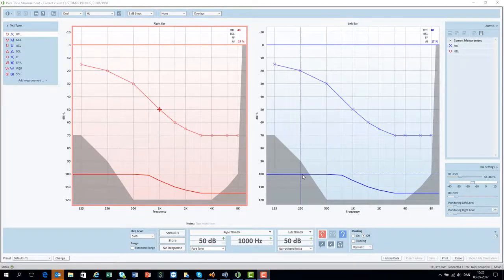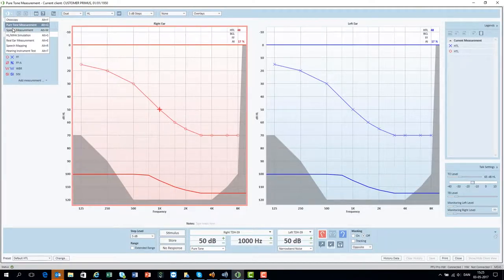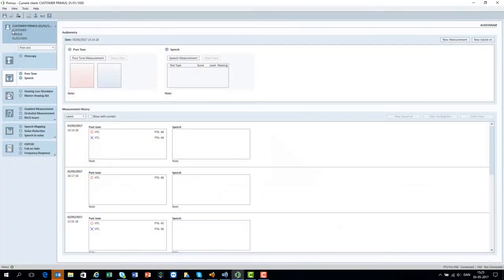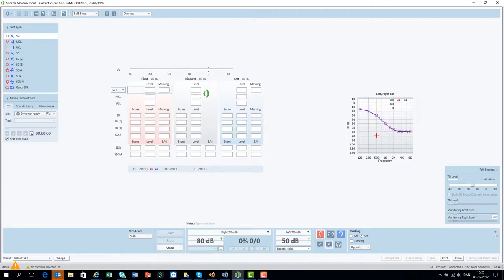In this video you'll learn how to operate the speech audiometer. The speech audiometry screen is similar to the other modules in Primus and the navigation principle is the same. In the top of the screen you have the toolbar.